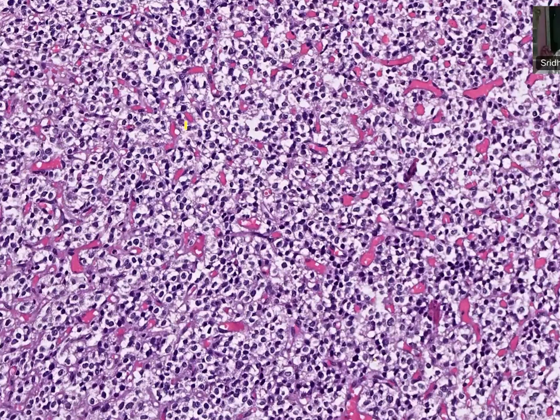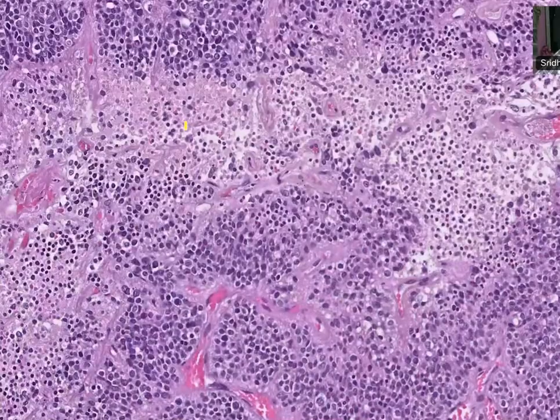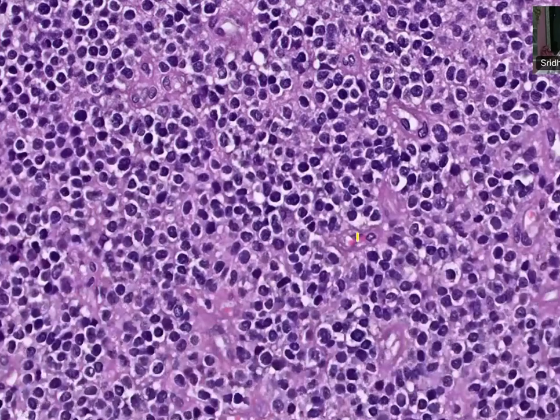But back to the 2-year-old baby. What are these areas? Necrosis. So cellular packed tumor, areas of necrosis. Anything different in the morphology in this slide? Same, highlighting better the perinuclear halo, right?